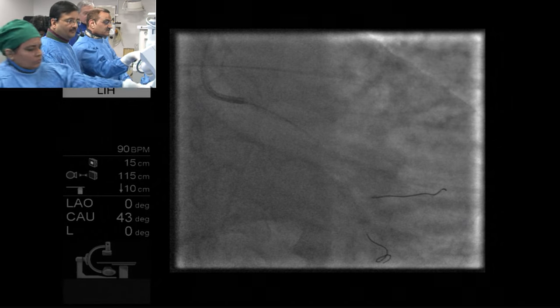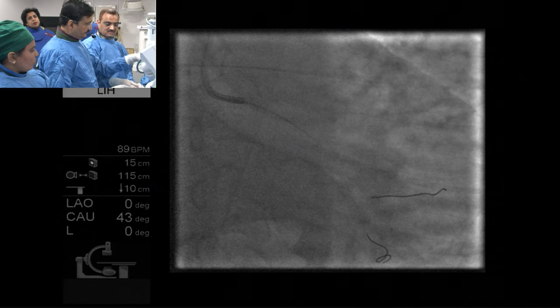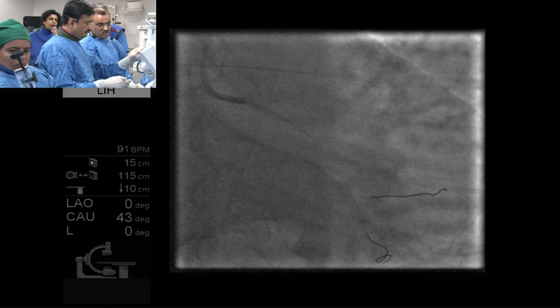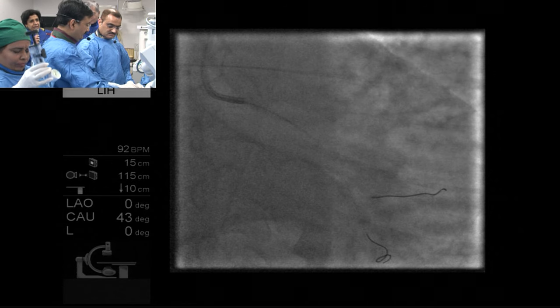I think I'm going to just stent it anyway, all the way, not into that branch, but still put a smaller stent in that OM branch, because I have a feeling we'll lose that branch otherwise. So we'll dilate this, then primary stenting if it goes in. If you go for a two-stent technique, I think a mini crush will be easier rather than a TAP, because apparently it's a case ideally suited for a TAP, but the recrossing might be a challenge.